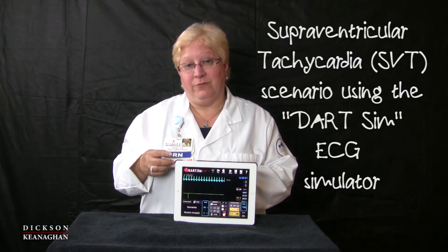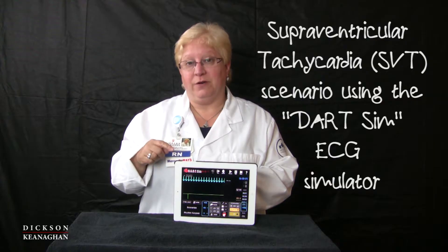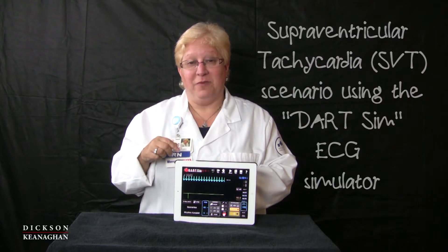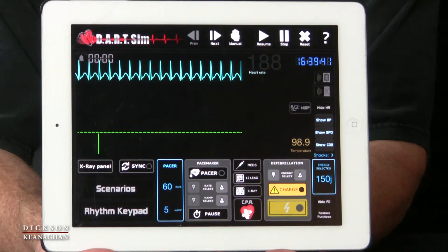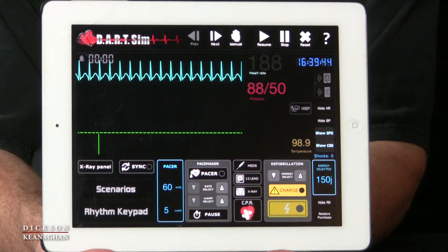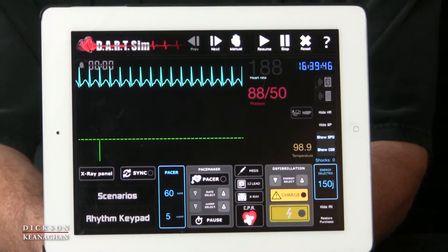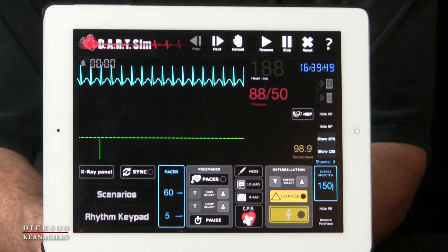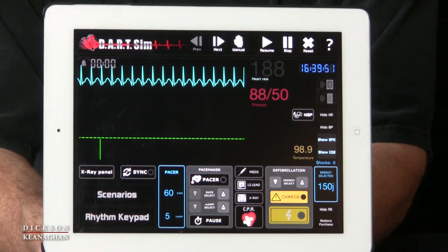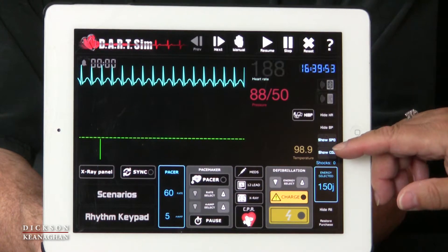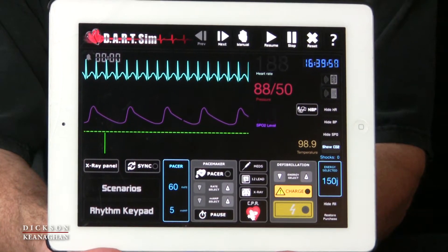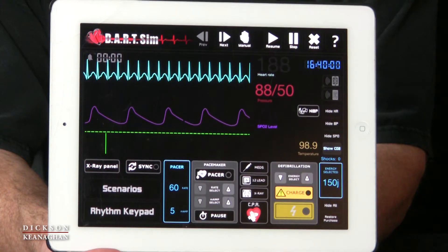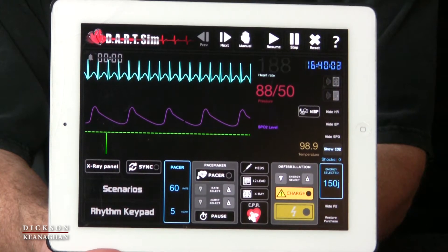We're going to review this rhythm using the dart sim simulator on my iPad. Now the heart rate at 188, we should be taking a blood pressure. So when I take the blood pressure, it's 88 over 50, so I'm thinking that patient is unstable. It looks like they might be having a hard time breathing, so maybe we'll put a pulse oximeter on them. We like oxygenation between 94 and 99, so that one looks extremely low. So we'll get some oxygen on that patient.